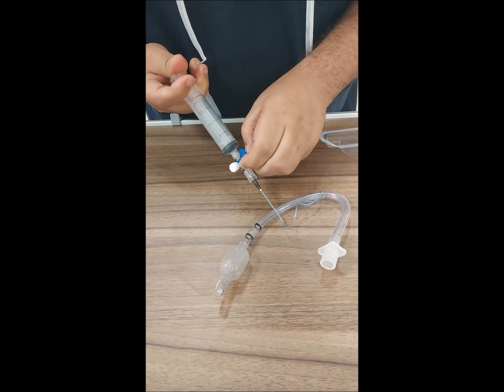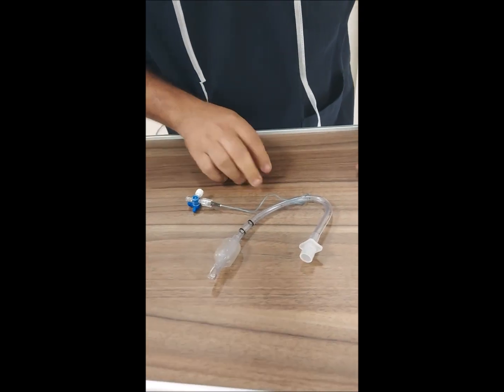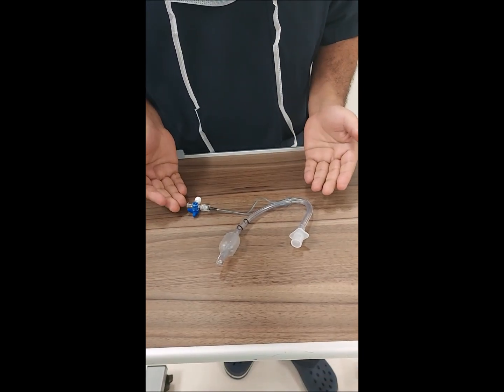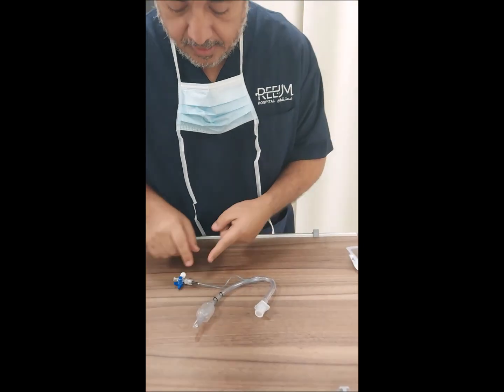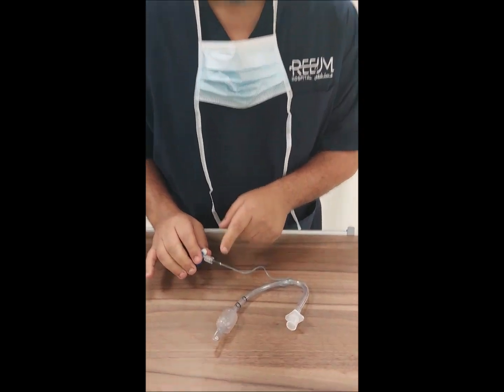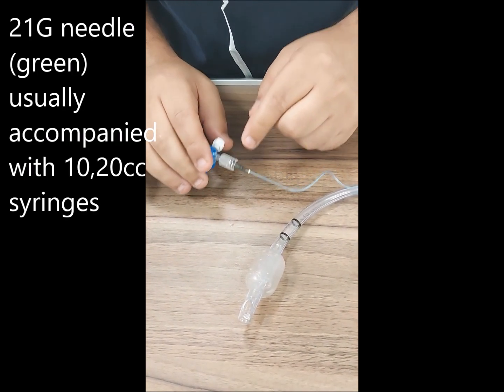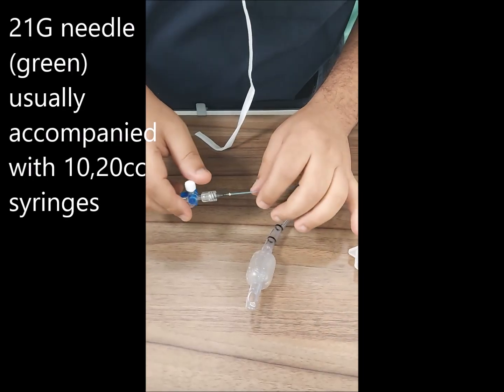Then, as simple, you just close the valve, and that's it. You have returned the tube inflated as much as you want. Okay. The size of 22 usually is sealed here. And if not, you can use the bigger one, which is 21, the green one, but slightly difficult to insert.